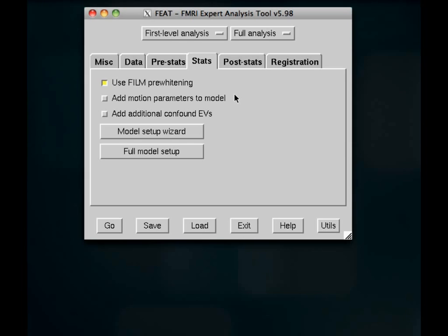These next two try to account for any confound or nuisance parameters, such as motion. For example, if you have a subject that moved a lot, which might be common in patient populations or child populations, you might want to do that to soak up any variance associated with head motion.